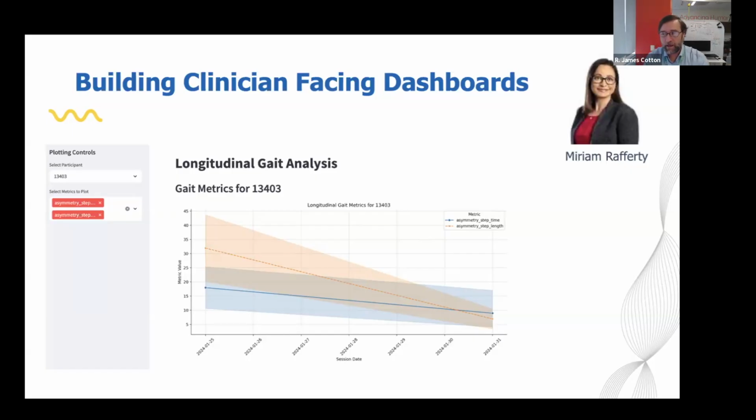It can work just fine, especially if you have a still camera, right? If you have a still camera, you've got no problems. And in the MOBI data set that we are including in the preprint, that was a still camera, and our root translation errors were on the order of 4 centimeters or something like that. So we can track position quite nicely if you have a still camera.